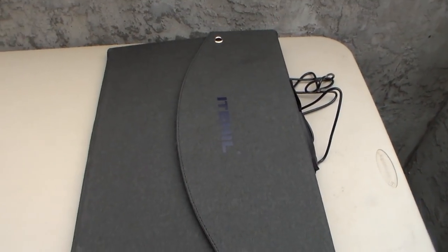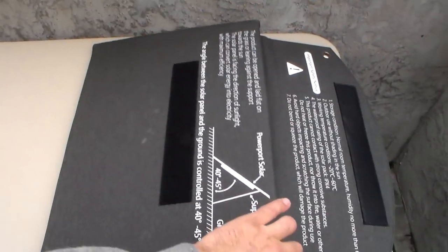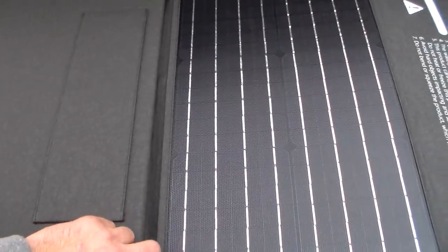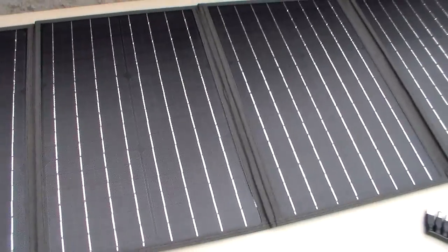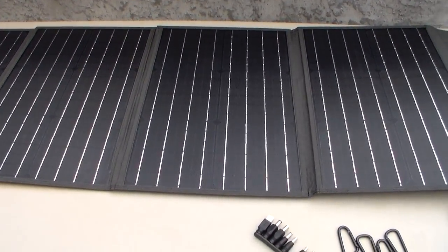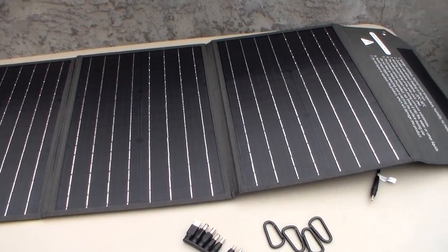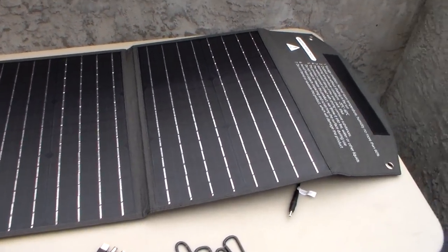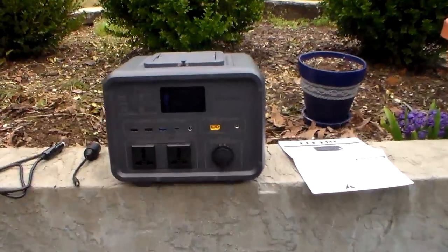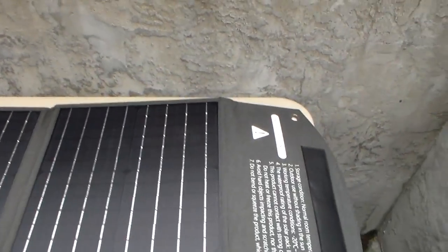This panel came to me with this unit, absolutely free. I like the size — most panels other companies make fold in half, but this one folds in four pieces. This panel is not as efficient as a glass-fronted panel, but it's actually quite good for the efficiency of this type of folding panel. This unit can take four of these panels — you can buy an adapter, and with four panels you could charge this unit very quickly, probably in under an hour and a half to two hours, depending on the sun.